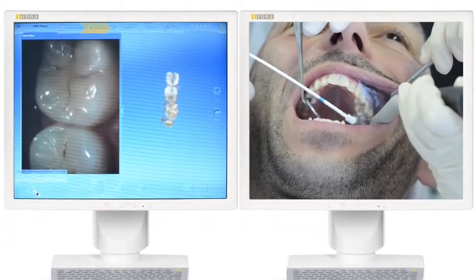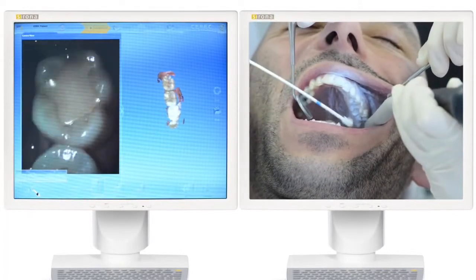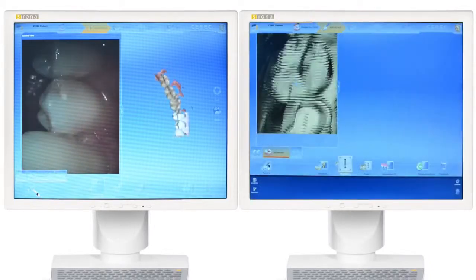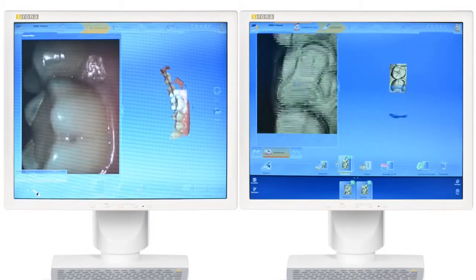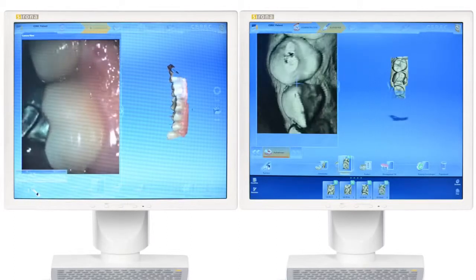In direct comparison, the BlueCam is convincing with its speed in single tooth restorations, despite requiring powder. Omnicam, being powder-free, inspires with a continuous flowing scan process and 3D images in natural color.